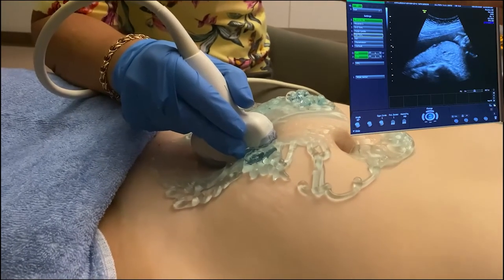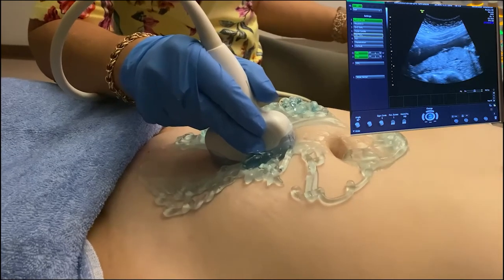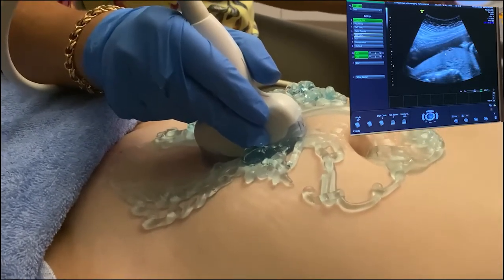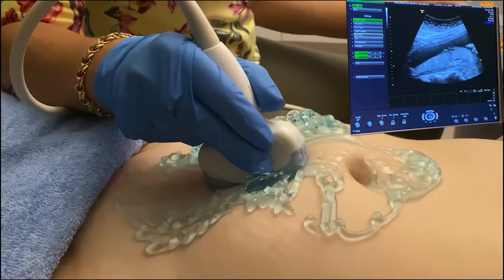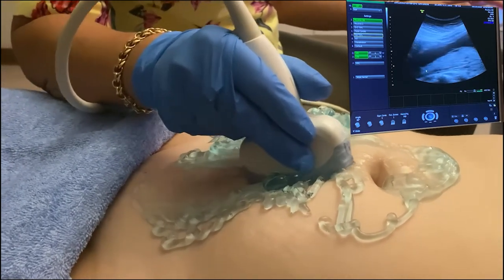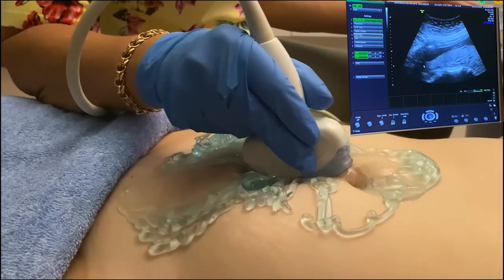I'm going to decrease my depth so that I can isolate just the placenta, and we can see very clearly, even in grayscale, the cord insertion. And we want the cord to be someplace in a nice thick portion of the placenta. In her placenta, the superior tip of it goes all the way to the fundus.